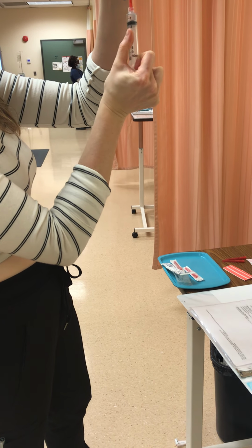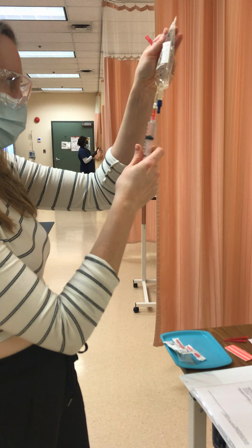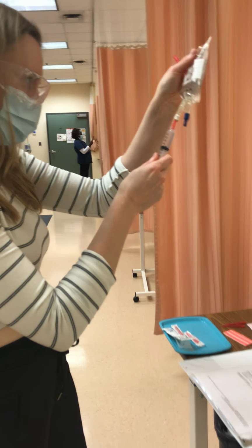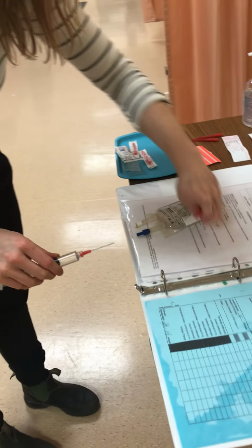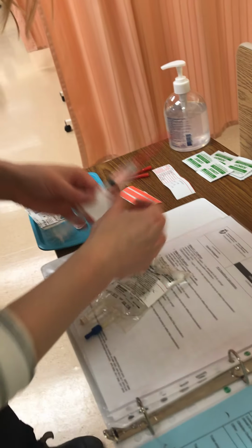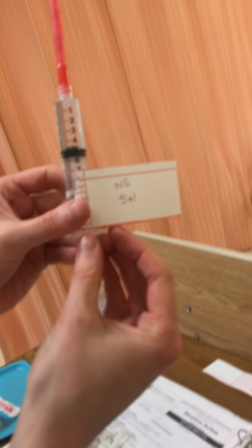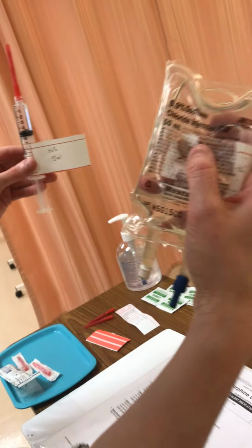Do it one more time because I've got a nice big bubble. Okay, good. So I'm going to make a label for that. I'm going to put this right here. And S 5 ml, just because they're both clear fluids, I don't want to mess that up. So that's 5 milliliters of normal saline withdrawn from 50. So this has now got 45 in it.